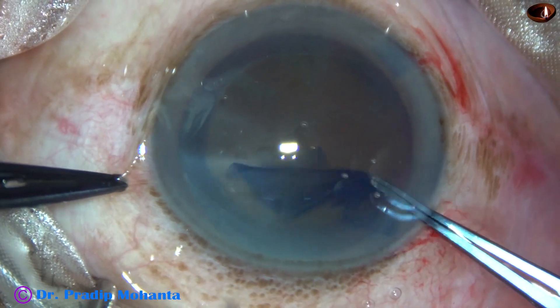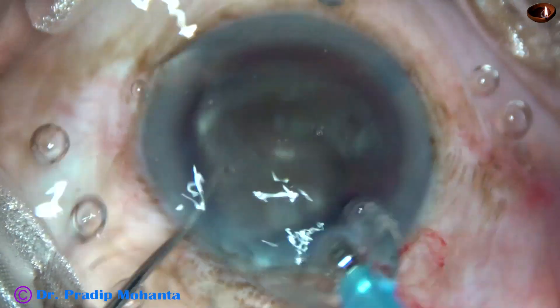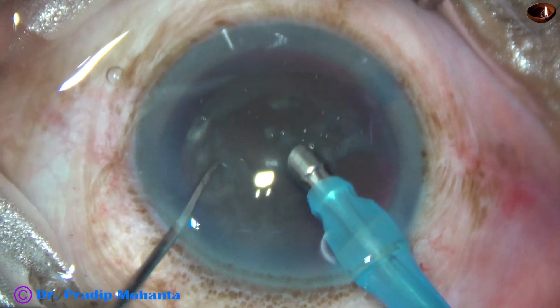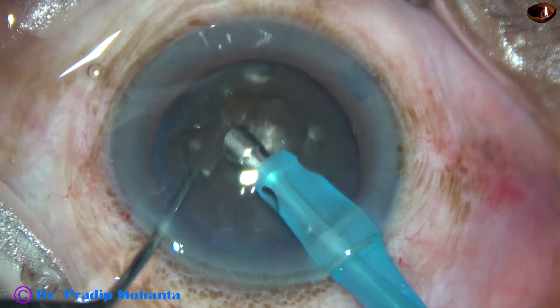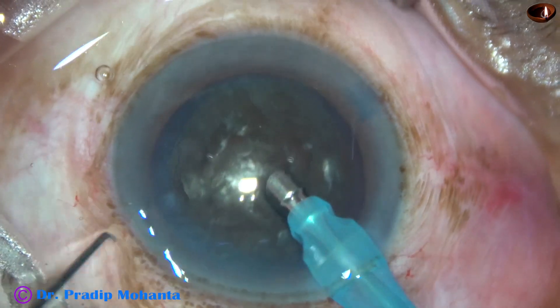After a large rexis and gentle hydrodesection, the anterior chamber is filled up with hydroxypropylmethylcellulose. Then the tip of the phaco needle goes in with its bevel down.